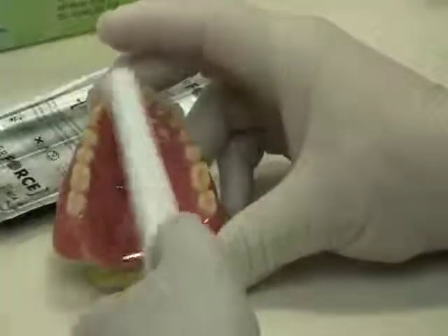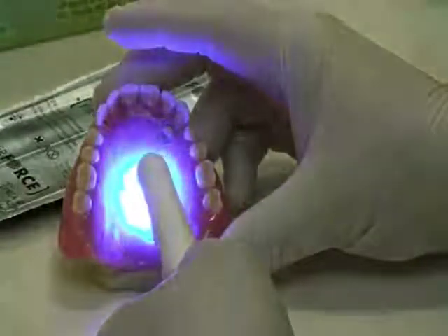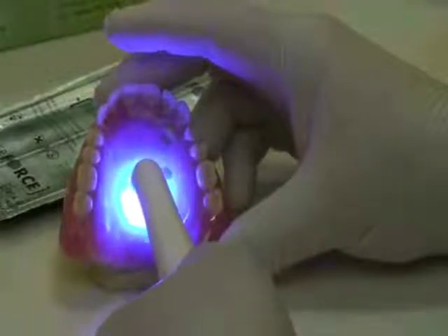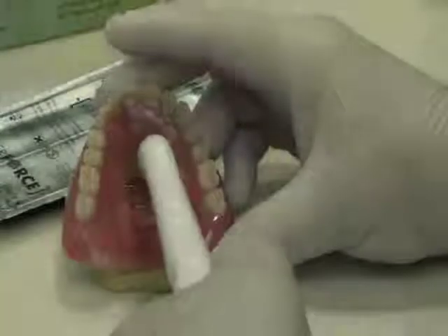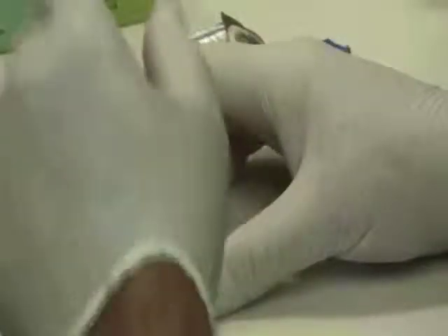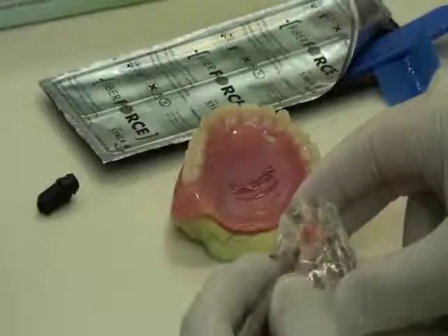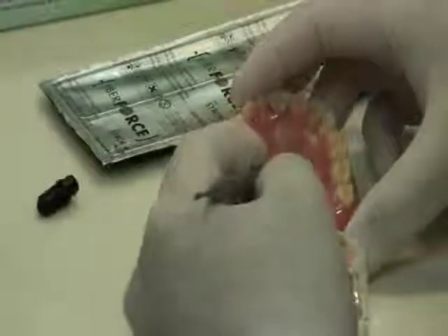Cure the resin and the material all at once using a handheld curing light or light oven. From here, fill the space and completely cover the Fiber Force with repair acrylic, and then place the appliance in the pressure pot to complete the curing process.